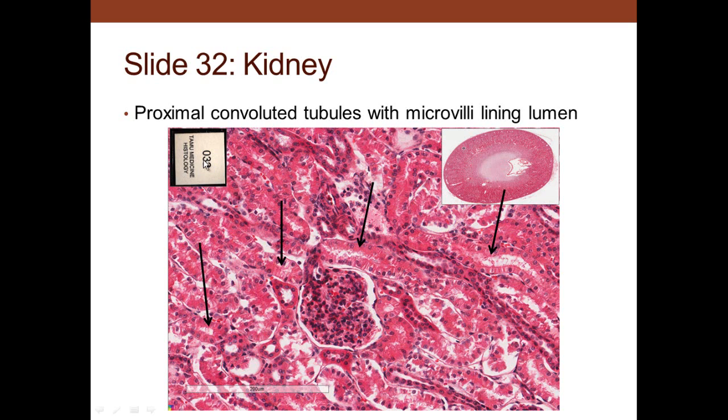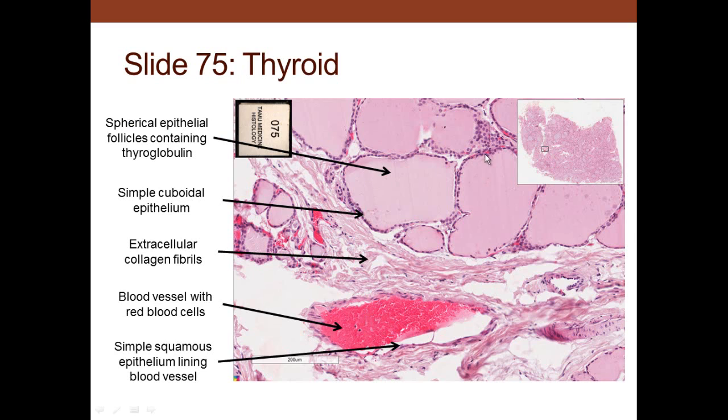You also can see a magnification if it happens to be there. But you can move this around with your pointer, and that will make this image move. Again, we're in this little box right in through there, and we can see that this is a thyroid gland, and this is a thyroid follicle.